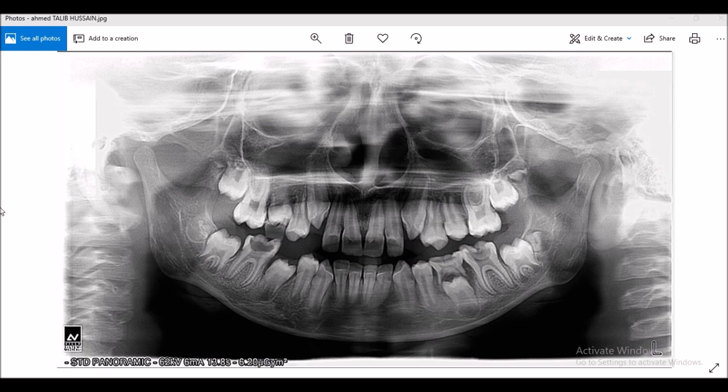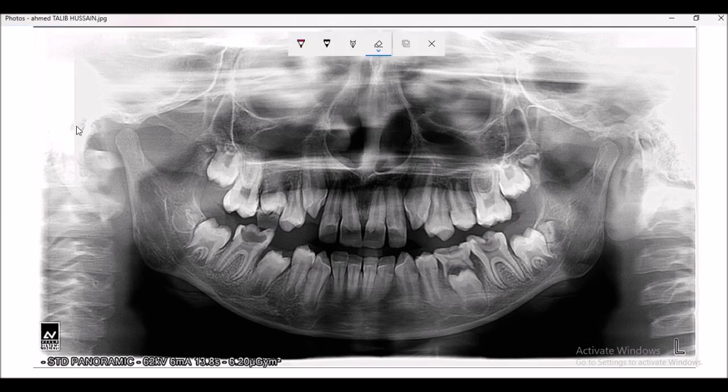Hi everyone, hope you are doing well. In today's lecture we will identify the anatomical landmarks that are visible on a dental panoramic tomograph, also known as an OPG. So let's begin with the landmarks.